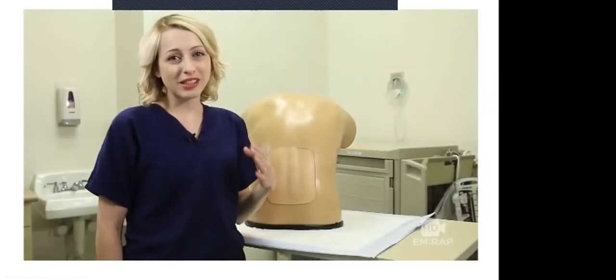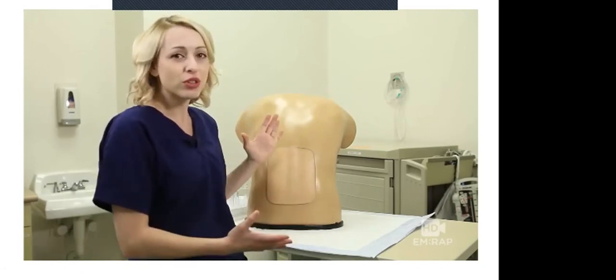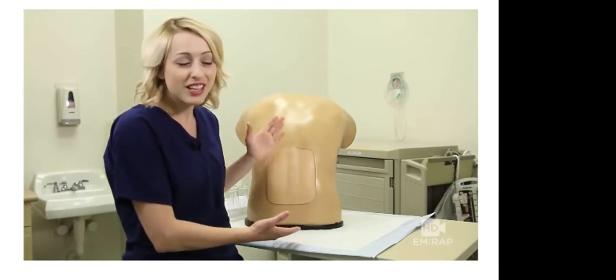I'm Dr. Jess Mason, and we're going to show you how to do a lumbar puncture. You want to position your patient either in lateral recumbent or, as shown here, sitting upright. This patient prefers to sit upright.